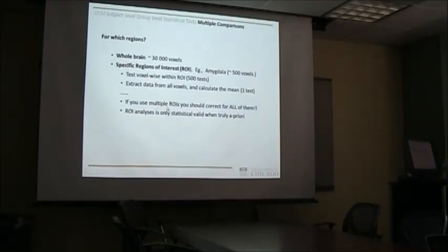There's two different things that are really tricky about this type of analysis. One is that, and actually people do this a lot, if you have multiple ROIs, multiple regions, which you often have, say, I'm maybe not interested in the whole brain, but I'm interested in the amygdala and the insula and the medial prefrontal cortex and the caudate and a bunch of these regions. And you want to do this region of interest analysis, you should correct for all your brain regions at once.